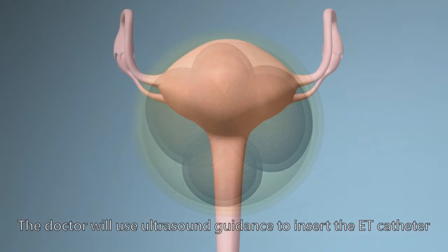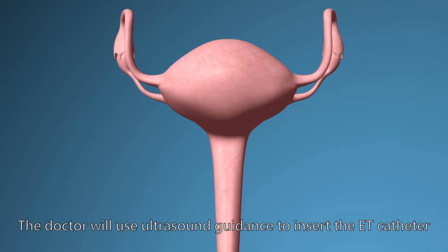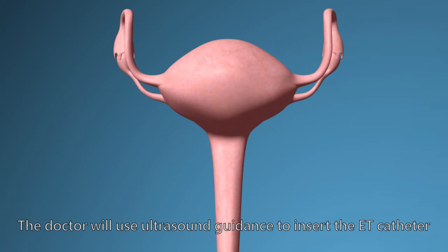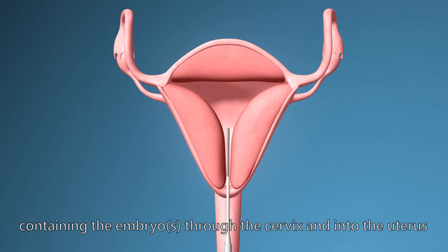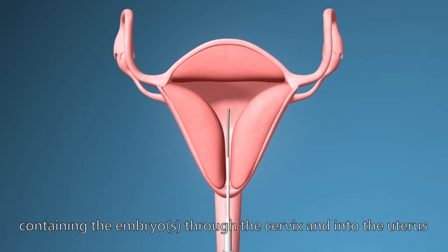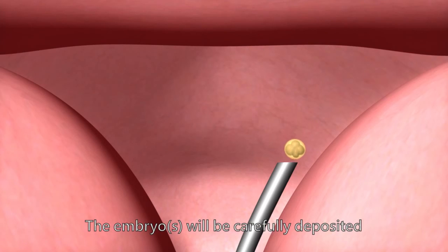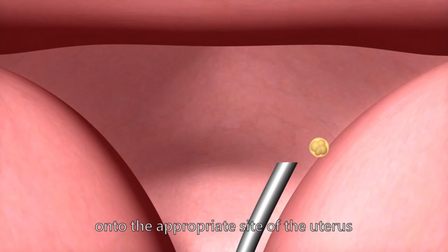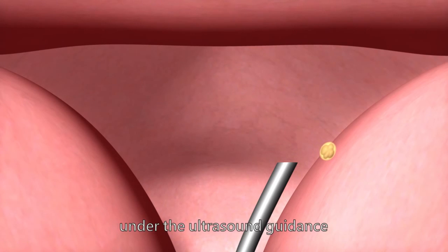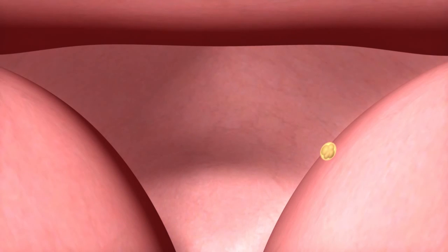The doctor will use ultrasound guidance to insert the ET catheter containing the embryo into the uterus. The embryo will be carefully deposited onto the appropriate side of the uterus under ultrasound guidance.